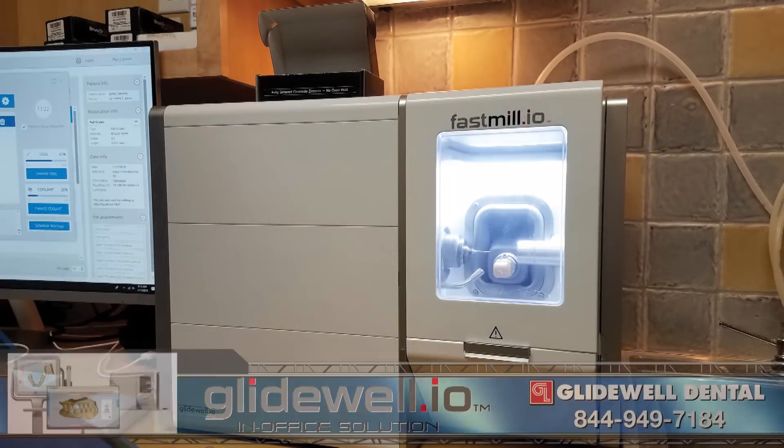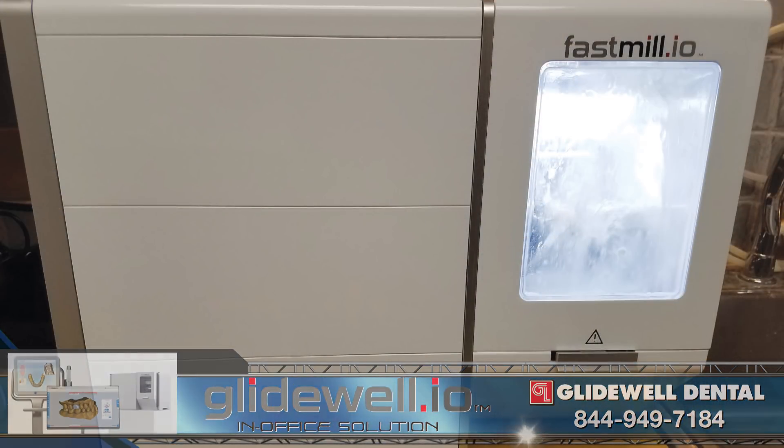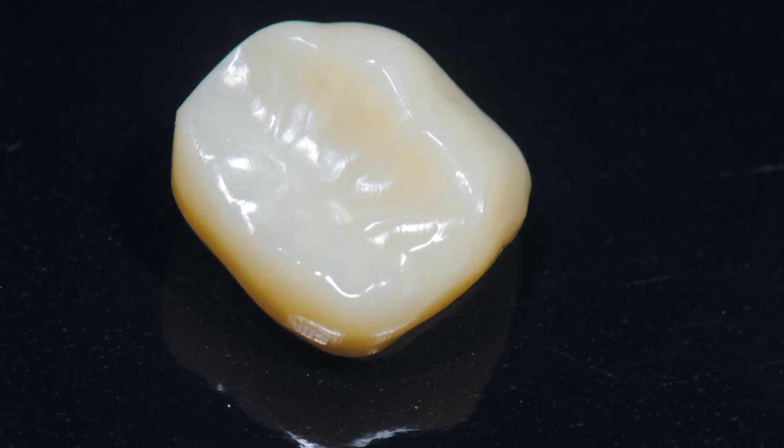The Bruxer Now crown was milled in less than 40 minutes using the Fast Mill in-office unit. The milled restoration was retrieved from the Fast Mill unit, the sprue removed, and the zirconia polished using the simple, user-friendly crown fabrication process.